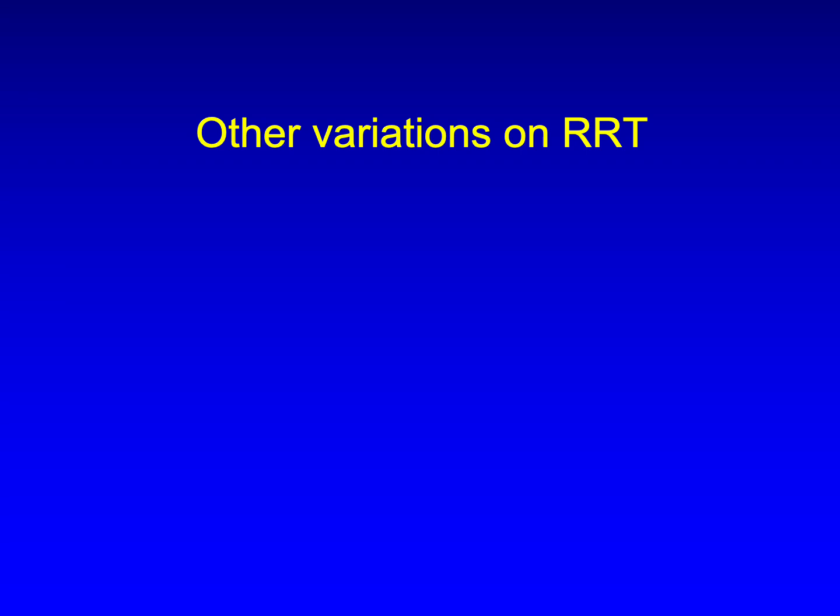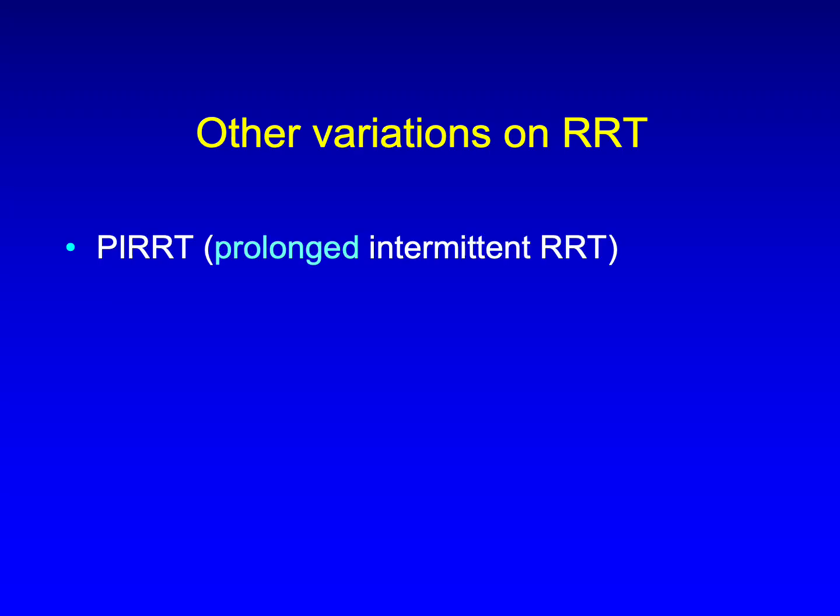Just think of intermittent hemodialysis as being at one end of the dialysis spectrum, 4 hours per treatment, maximum efficiency, and CVVHDF being at the other end, 24/7 treatment, very slow but best tolerated. So here they are, and you may encounter them in different hospitals, different ICUs, and if you forget the acronyms, you can always look them up on your phone.